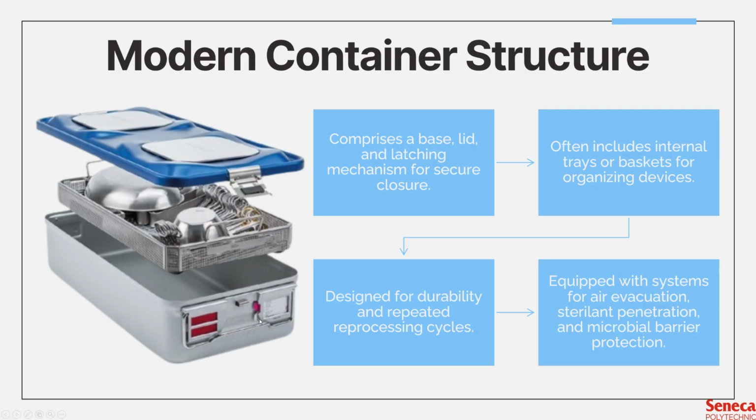From then on, you would have to match the tray contents with the container name, which eats up the technician's time. Let's say you built your tray already, but the container wasn't disinfected yet. You would have to wait for the container to go through the washer disinfector and dry before you could put the tray inside, which really messes with the workflow in the MDRD.